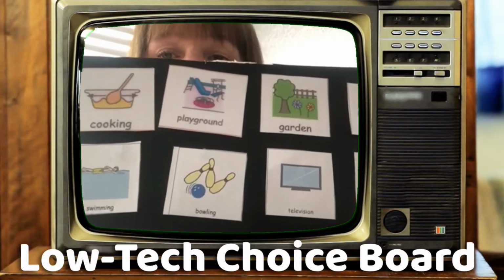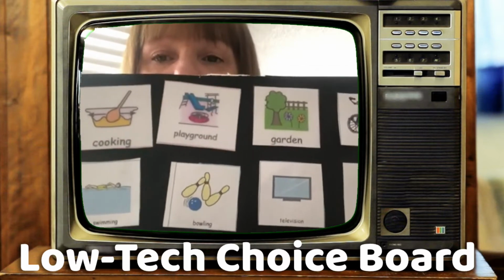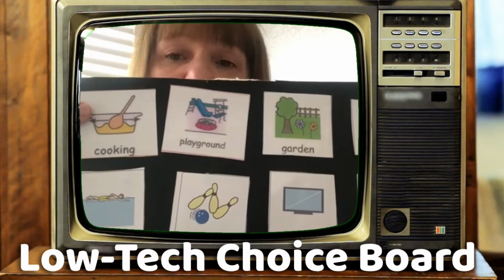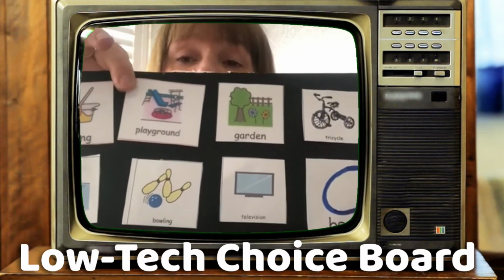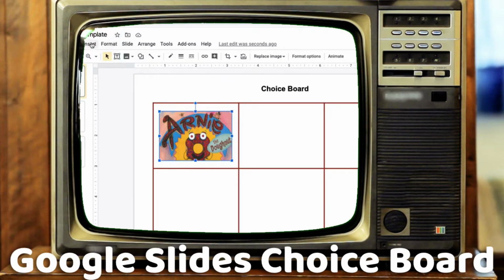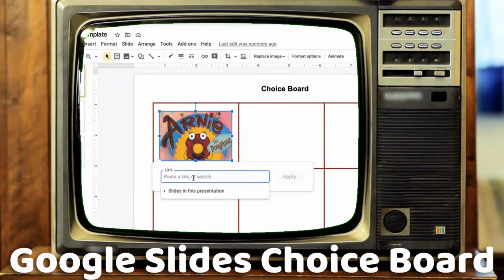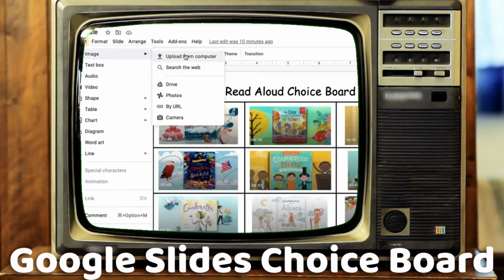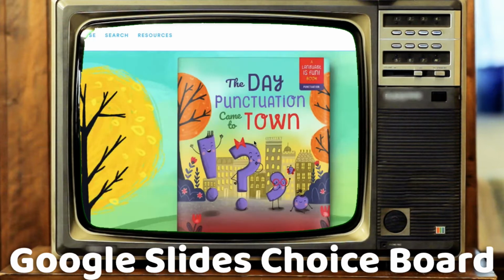Here's an example of a low-tech choice board. This woman printed out some icons, laminated them, and put them on magnets, and then just used a sheet pan. She can easily switch off the icons. It's portable, very cost-effective. In this example, this teacher used Google Slides to make a choice board. And in this example, she used it for the choosing of an audiobook. The same process could go into making icons or pictures for communication. And this could be used and loaded on a tablet or an interactive panel, or even printed off on paper and laminated.